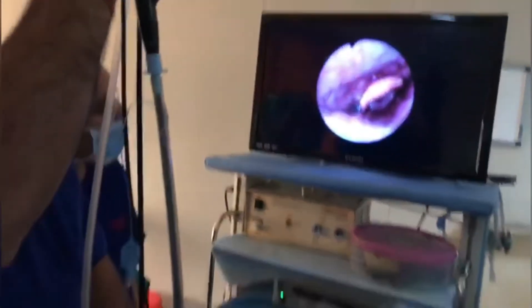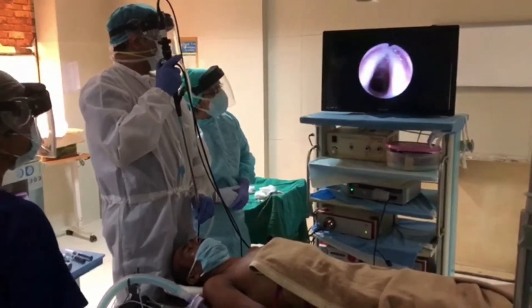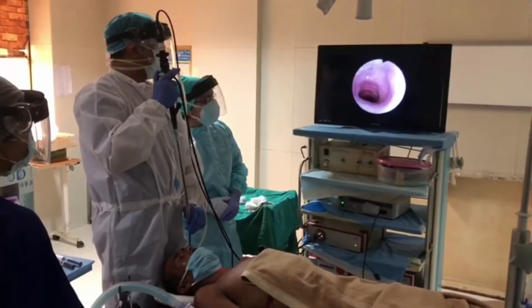First we see the nasal turbinates, then we reach the nasopharynx, and then we reach the vocal cords. From there we go further down and we see the tracheal rings.